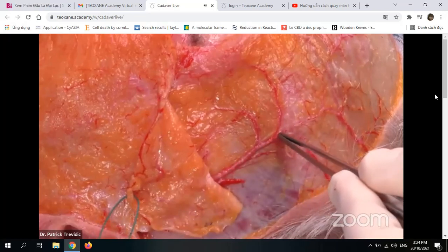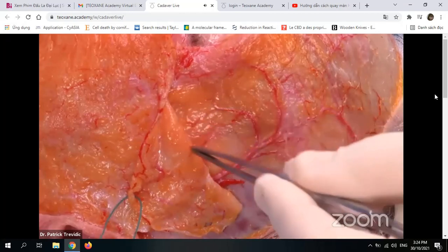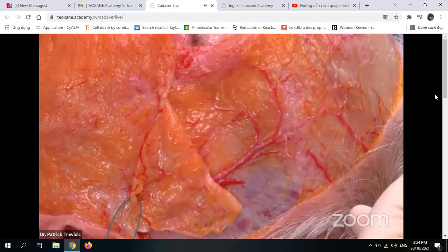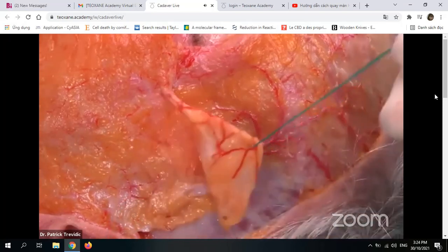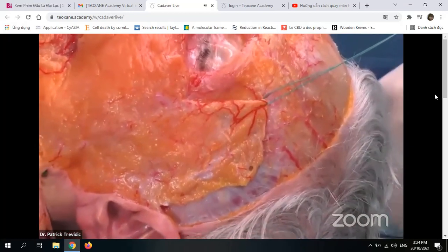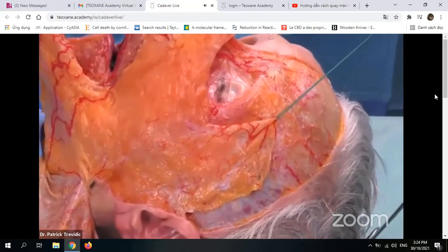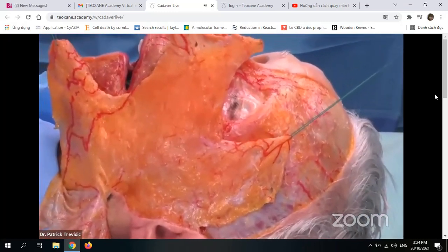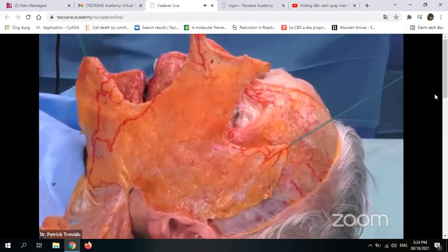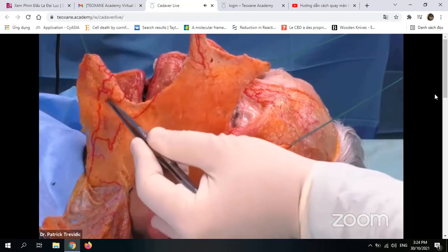That is a big artery, and the other danger in the temple area will be deep in the muscle and not in the bone. So if we zoom out and go on the profile, I will lift the fat. And you can see, if we stay a little bit like this and zoom out here, you can see very well in the fat all the path of the artery superficially.